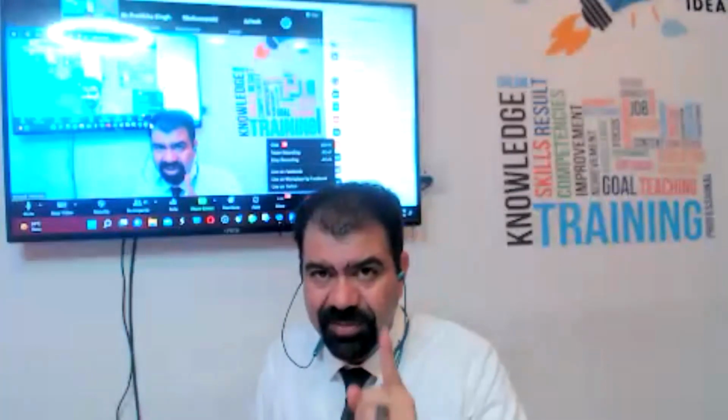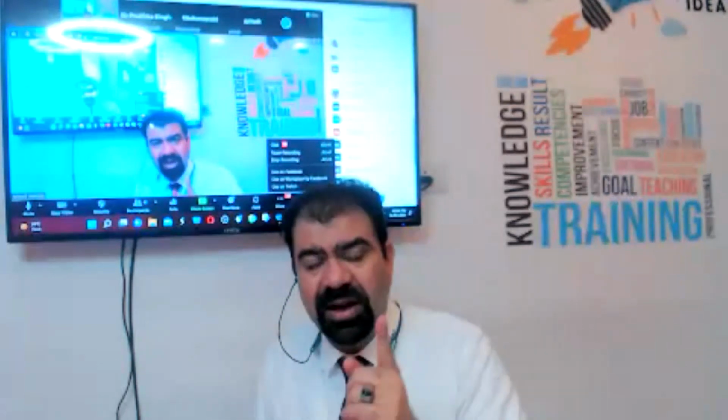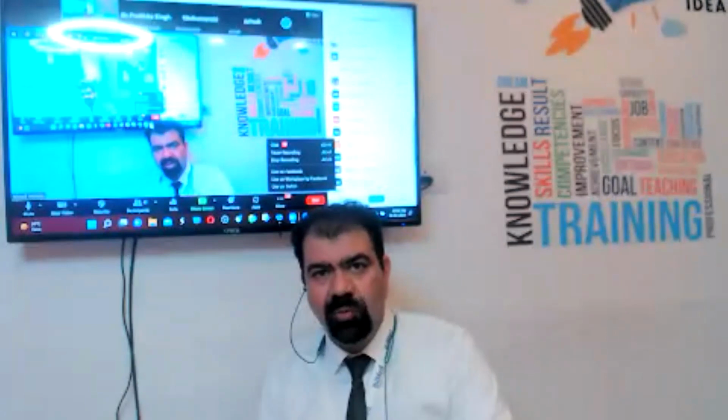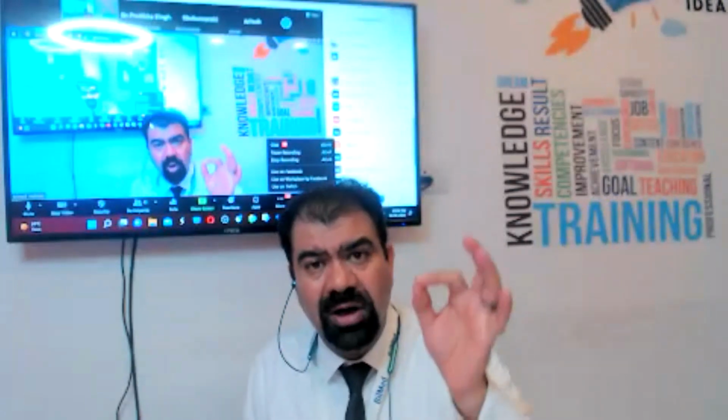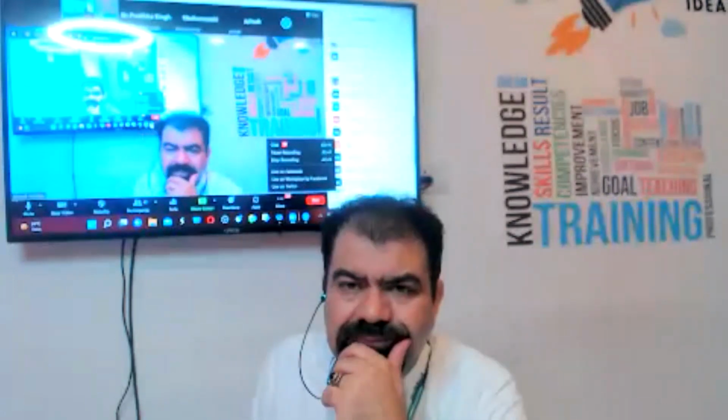Now, try to understand my point. If you are having 4 or 5 millimeters of endometrium and there is an RPOC, there are very high chances that you will miss that small RPOC. Yes or no? Yes, sir. What to do to look for that small RPOC, which is not getting resolved by your machine because it is very small? Think. Color flow. Very good.